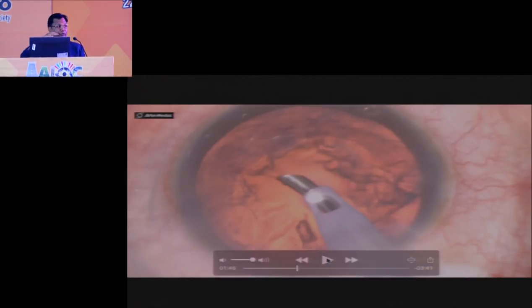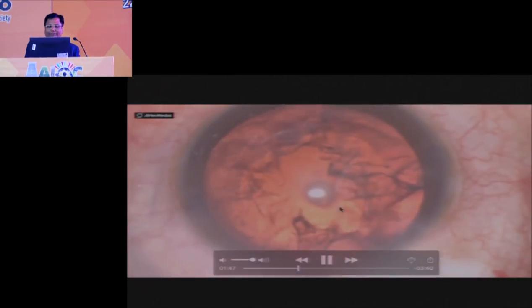And in hypotony, that is the tendency of the eye, when you emulsify the nucleus, in this case it was a very simple case, but when you do hard cataracts, some pieces may hide behind the iris because of the hypotony. So after that, in the deep anterior chamber, you check whether any pieces have remained, in a very mild mode of energy.